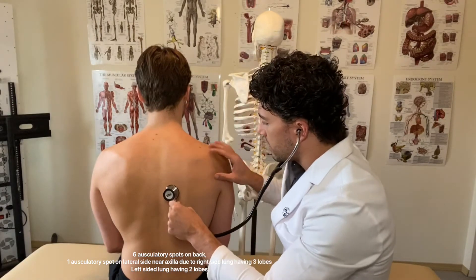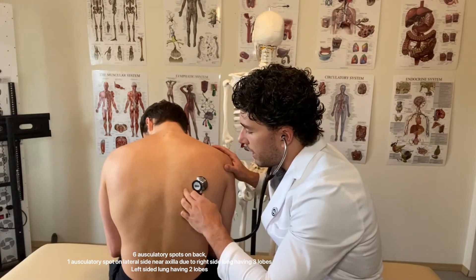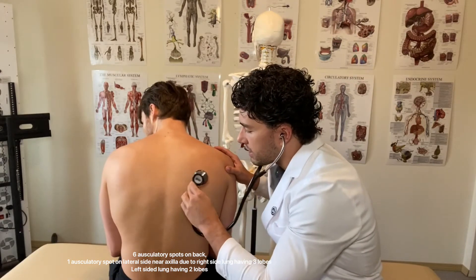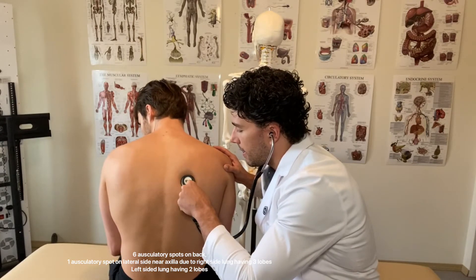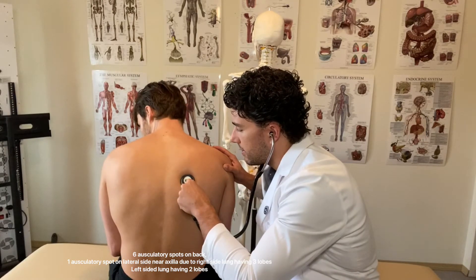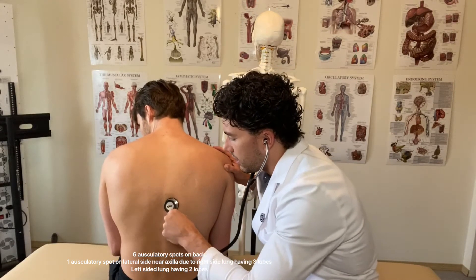I'm going to ask you to flex down. I'm going to move the scapula out of the way — the scapula, lower rhomboid major muscle — I can feel the ribs. That's the triangle of auscultation. Deep breath in. It's the best spot to hear that part of the lungs.